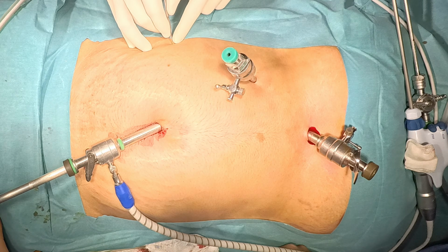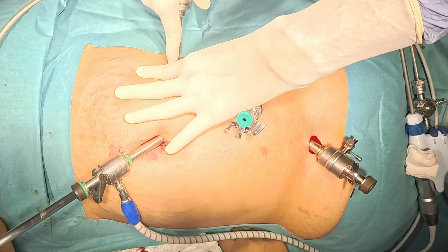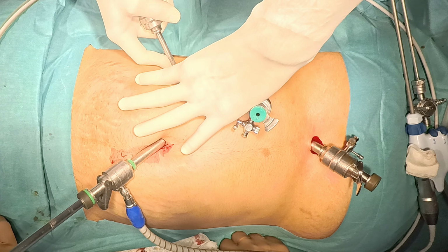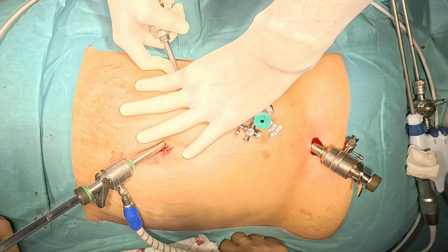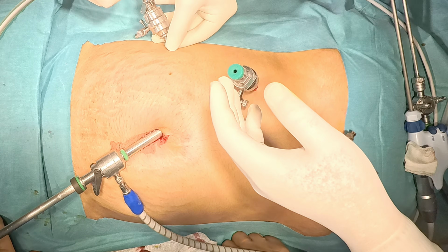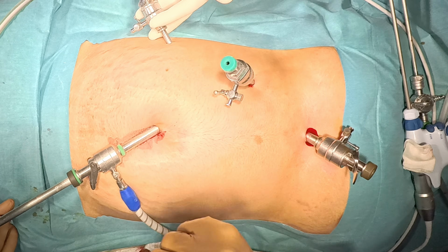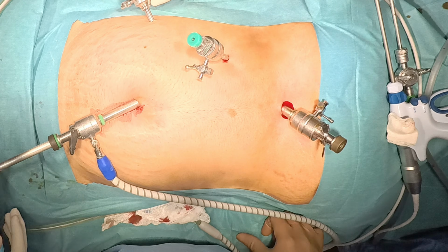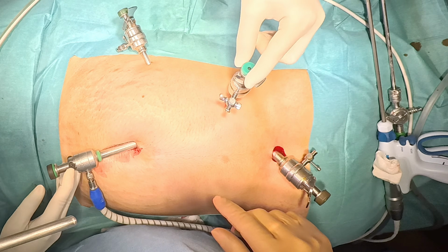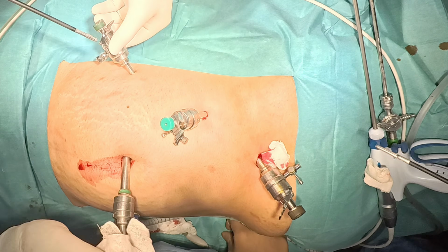It gives anteromedial or anterolateral traction. Now, the fourth port should be at the anterior axillary line at the level of the umbilicus, or it may be 7.5 centimeters lateral and below the third port on the anterior axillary line. This also you can ask your assistant to put and then the assistant will use the atraumatic grasper to hold the fundus of the gallbladder. After that, the patient orientation on the table will be changed, head up and right up. All four ports are in position and then we will start the cholecystectomy.